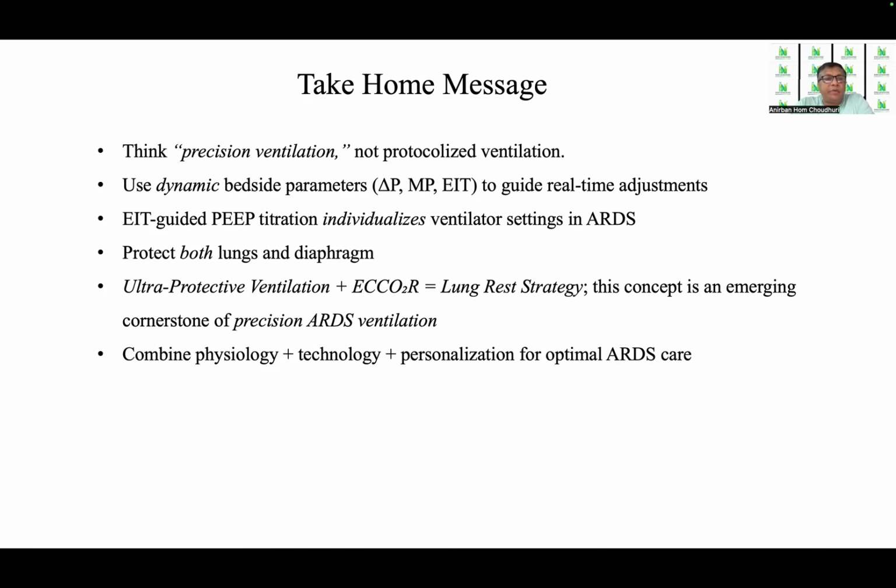There is a need to protect both the lungs and the diaphragm and prevent ventilator-induced diaphragmatic dysfunction. So ultraprotective ventilation and ECCO2R give a total lung rest strategy, and this concept is an emerging cornerstone of precision ARDS ventilation. And also, combined physiology, technology, and personalization are most important for optimal ARDS care. Thank you.